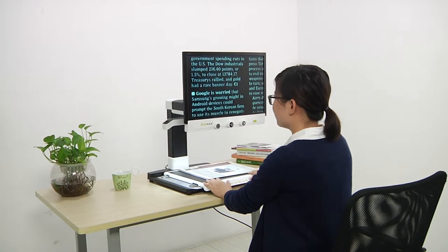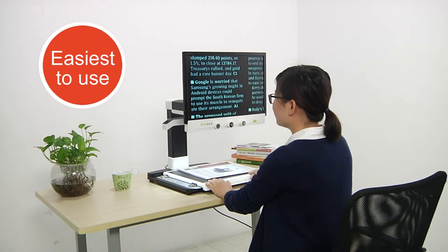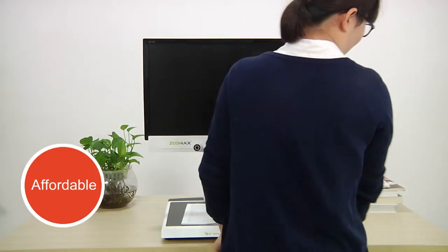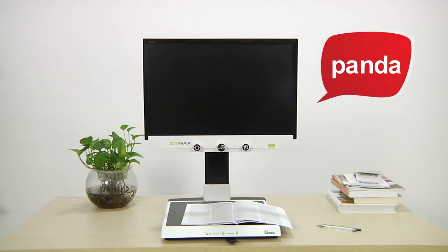Zoomax Panda offers more. It is the easiest to use, apartment and office sized, and affordable desktop video magnifier in the market. It would be a very good choice for many people.